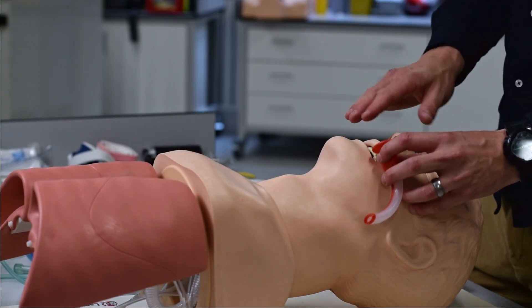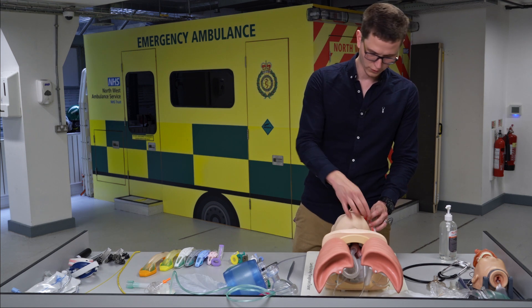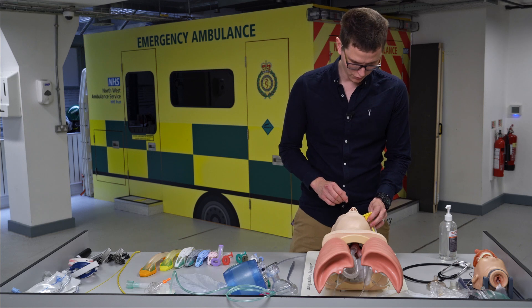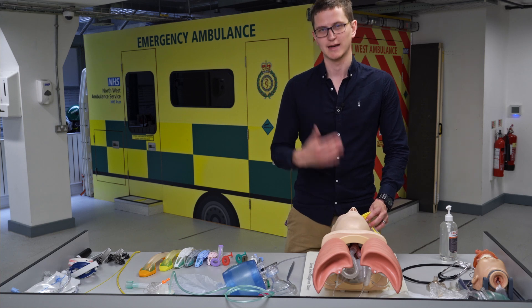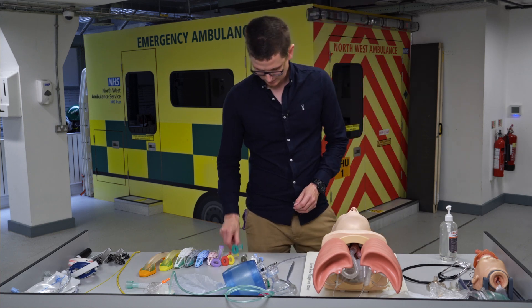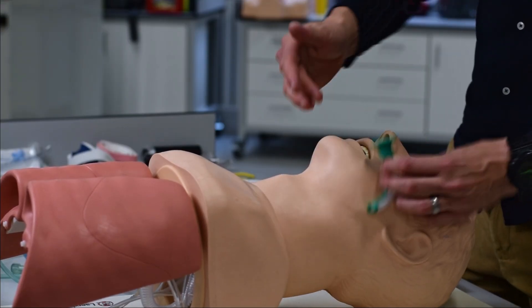How do you measure it? From the teeth to the corner of the jaw. As you can see, this one is too big — it's going beyond the corner of the jaw. Remember, color doesn't always tell you if it's the right size or wrong size. Different manufacturers make different colors, so we can't say a yellow is always the same size. Different companies make different sizes.